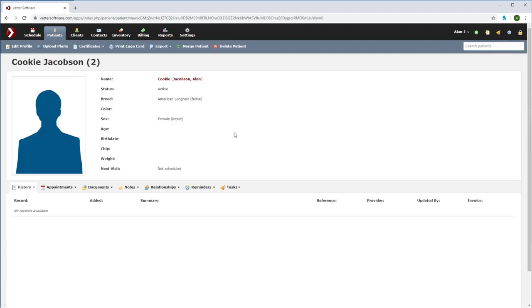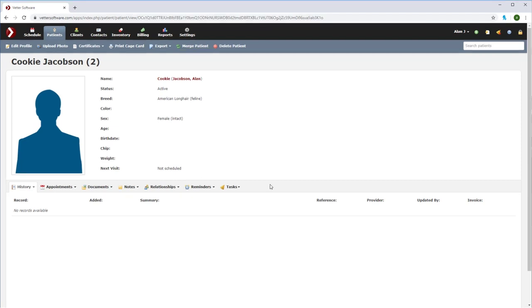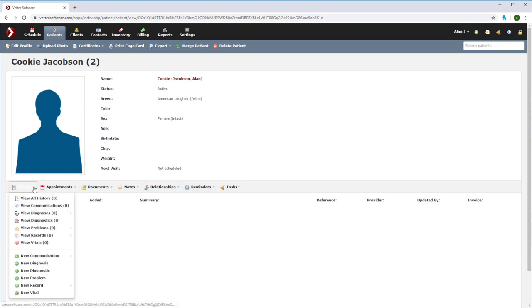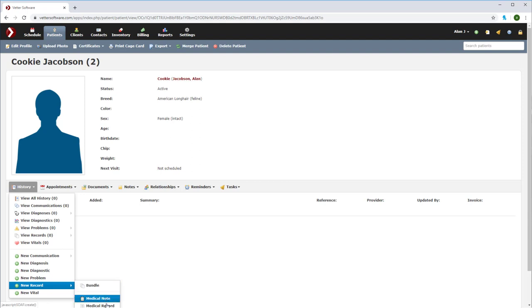In this case, let's assume the veterinarian has requested four view radiographs on Cookie. To make a request for imaging, go to the history dropdown and select new record. Now select medical record.